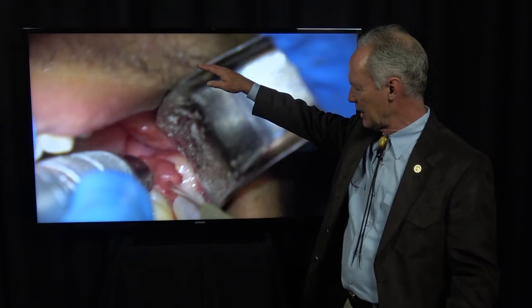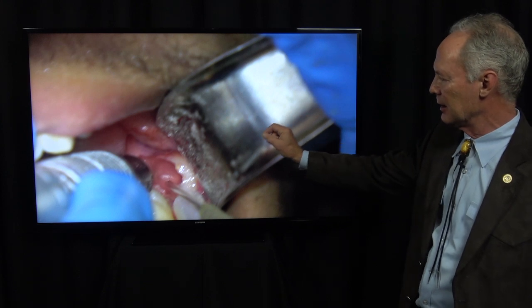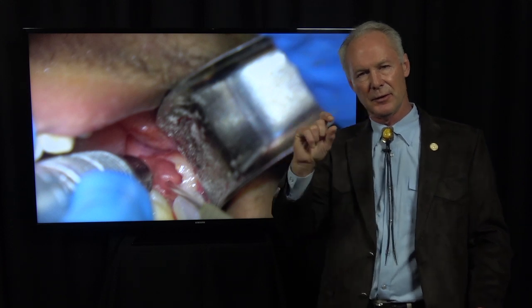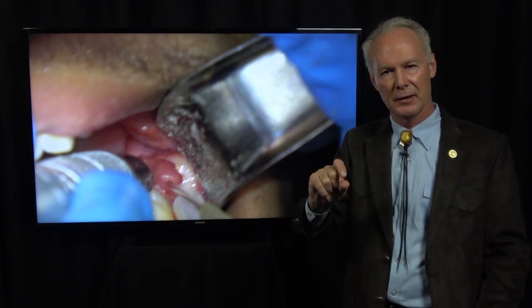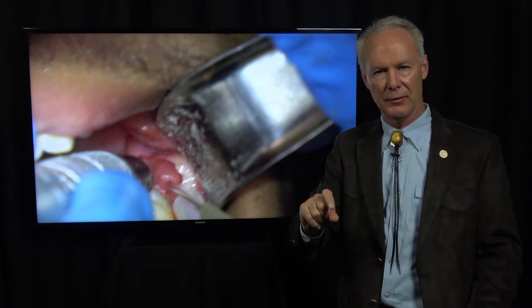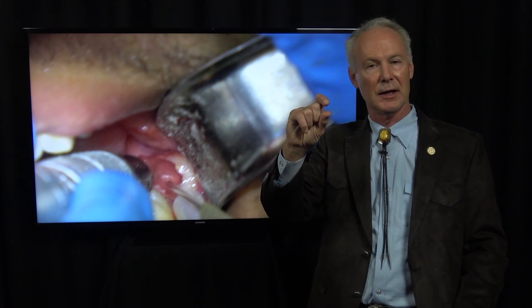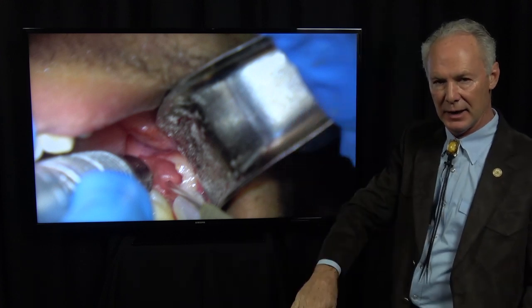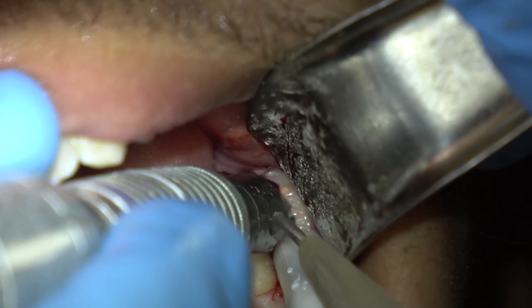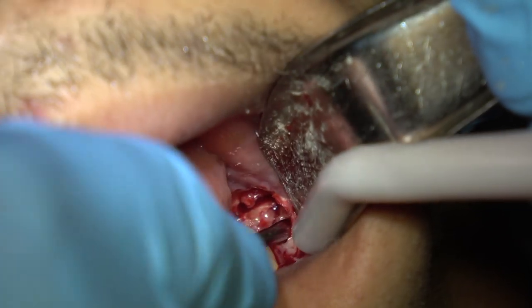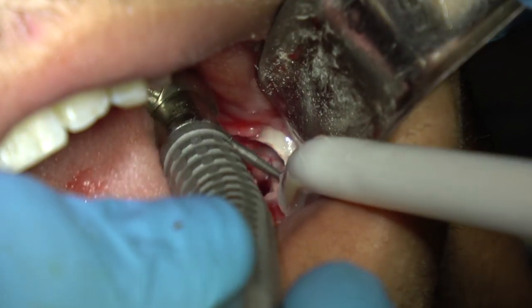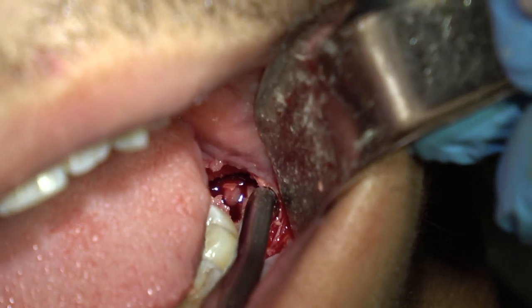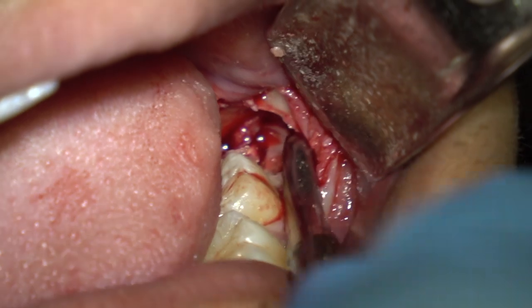The coronal part came out and now we've got the roots remaining, so you've got to cut a little further through the furca. Be sure you looked at a radiograph ahead of time to see how far the furcation is from the inferior alveolar nerve. That's another reason you want about a quarter of the root formed — you've got some space between the furcation and the inferior alveolar nerve. I'm creating a little more space on the distal and the facial, cutting all the way through the furcation, then removing that distal piece.